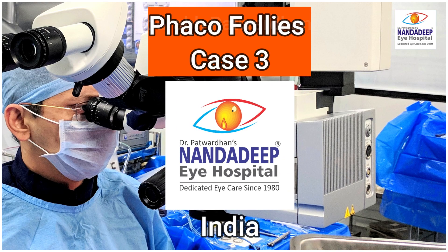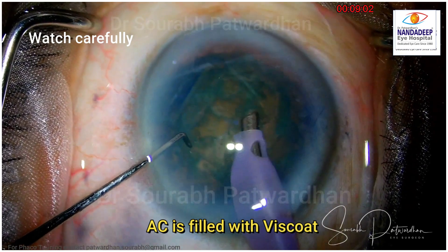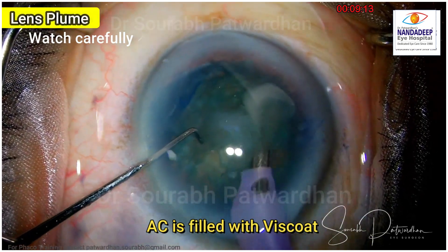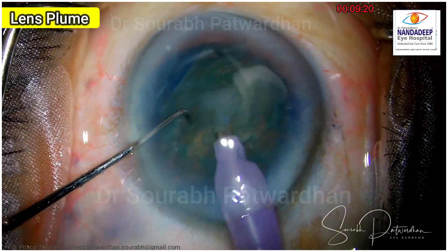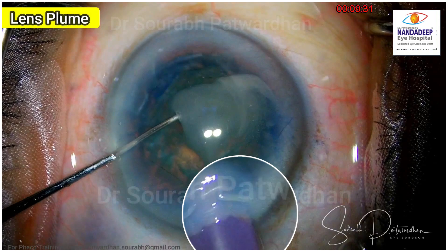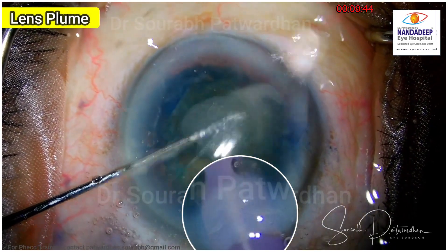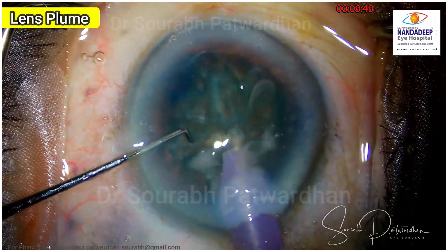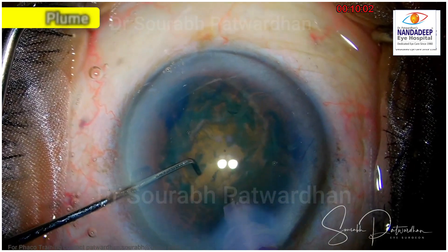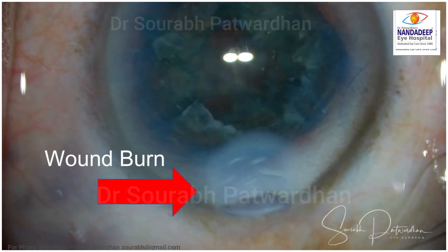Let's move on to case number 3. Watch this case very carefully. The surgeon has filled the anterior chamber with Viscoat completely — no cohesive OVD was placed underneath. So there is no other OVD or fluid other than Viscoat in the anterior chamber. What we are seeing are the lens plumes, and what we need to observe is the incision area. You can see it is becoming whitish, indicating a wound burn. The tip was blocked because of the Viscoat, low vacuum was used and it could not clear off the Viscoat. As phaco energy was delivered, the energy stayed around the phaco tip causing this wound burn. The surgeon was oblivious to this and completed the surgery, but at the end realized it was a very severe wound burn.